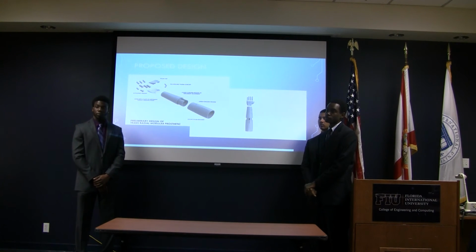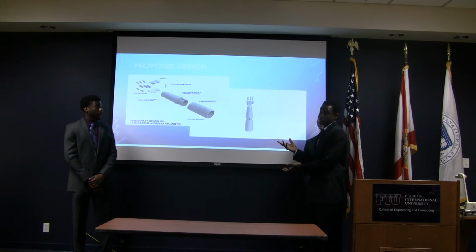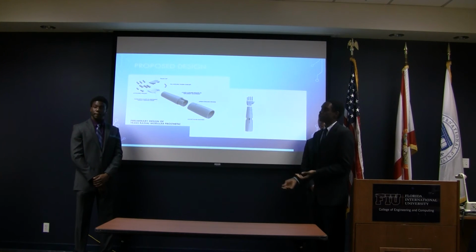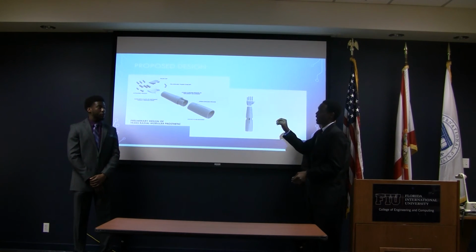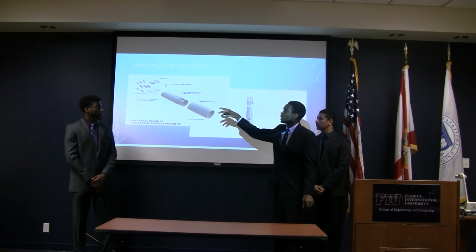You haven't got too far along on that yet. Okay, so you want to know, I'm guessing that's right? Yeah, so you're asking how it will be driven, like how it will function? We want to delve into adding electrical motors into the cavity of the hand that will drive the fingers.